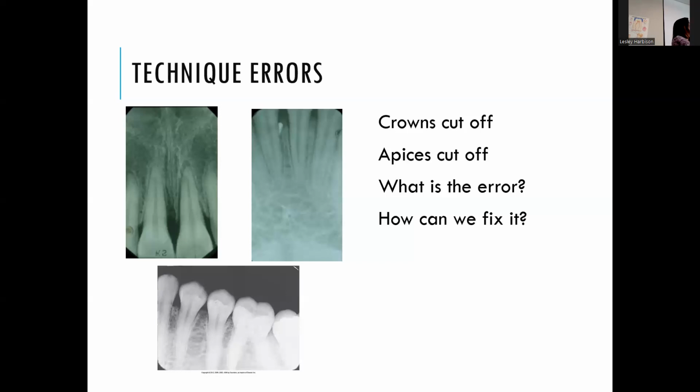Say, this is where I want it, and then have Dexter bite, instead of having the closing of Dexter push it down. And I know sometimes Dexter's tongue is a nightmare, but practice it the best you can. But that's what happens very oftentimes. Patients don't bite down. We don't seat it fully enough. Yeah.